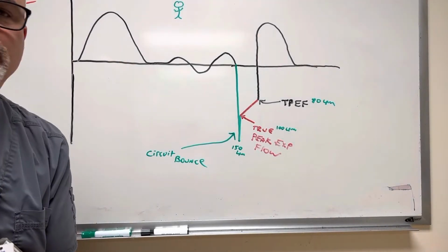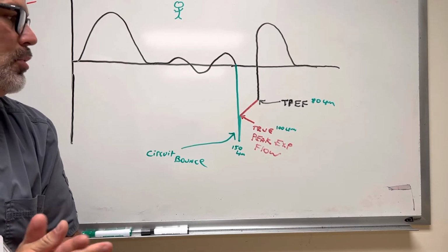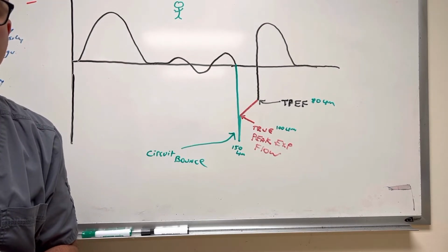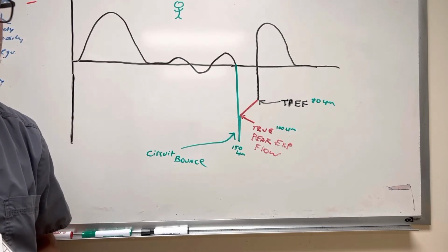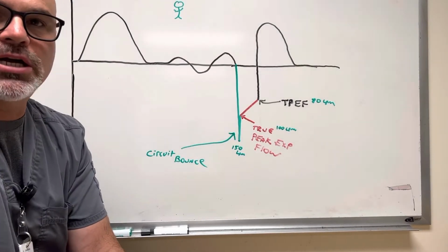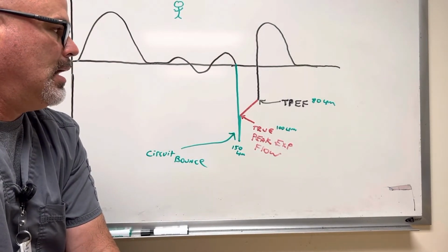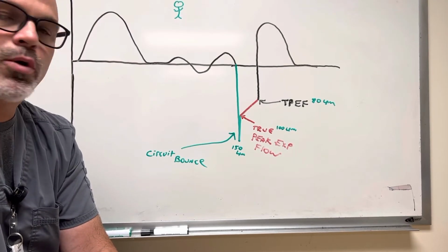So we're going to talk a little bit about how changing the way we look at and document what our termination of peak expiratory flow is on our patients in APRV. Okay, so we had a little meeting with Keith Kerr, myself, and Dr. Habashi over some APRV techniques and things we were seeing and things we weren't seeing.